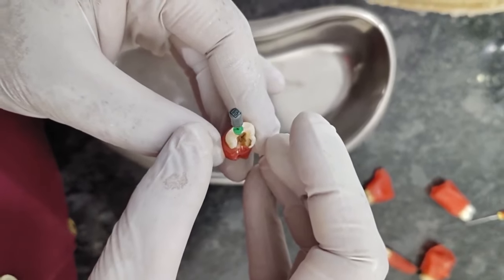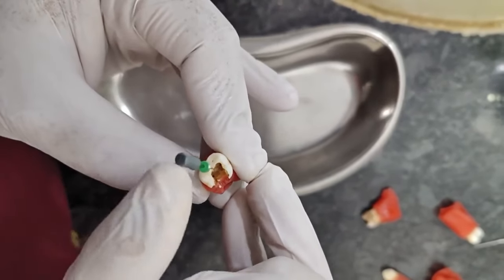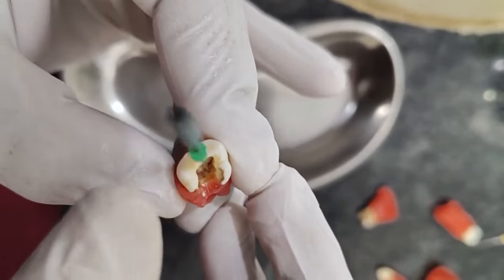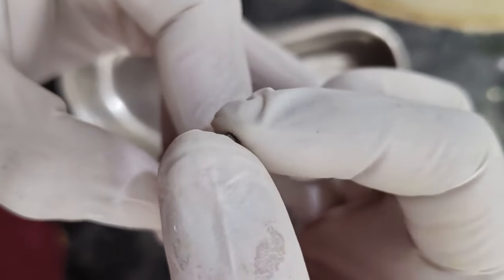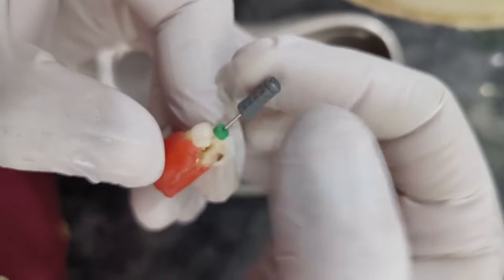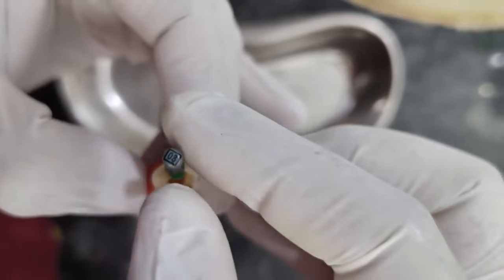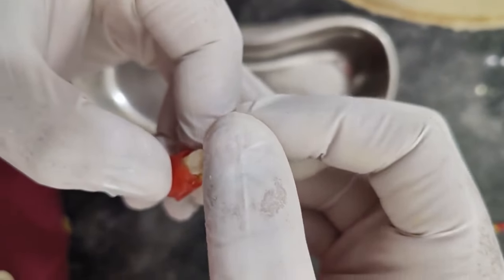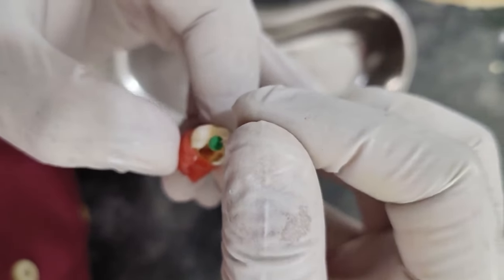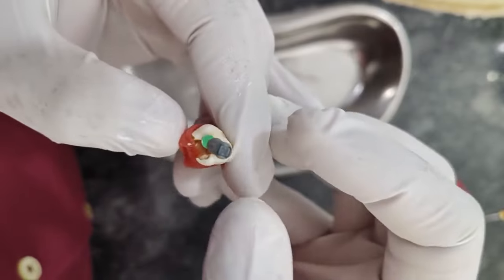Now, this one is the distobuccal canal. You can see it's very thin. So again, we are entering here with a little bit of watch winding motion. This is watch winding motion, just 30 degree on and off rotation. Now we have got the patency of the canal. Take it out. And then this is the palatal canal of the upper molar tooth.